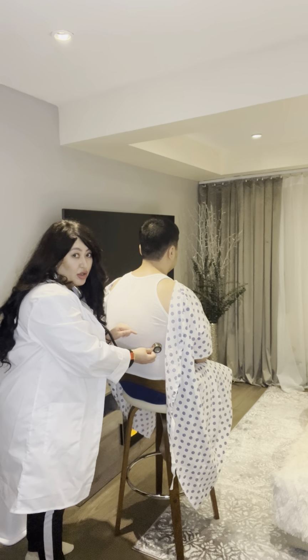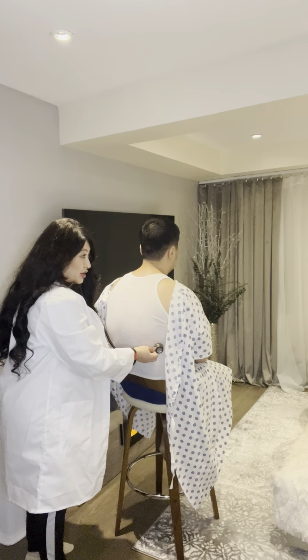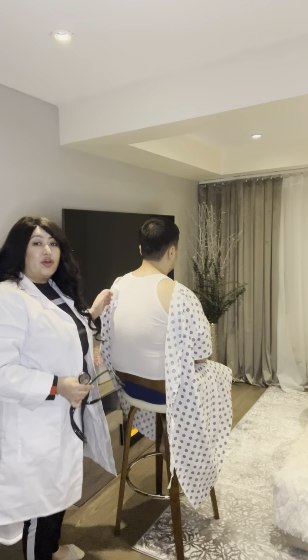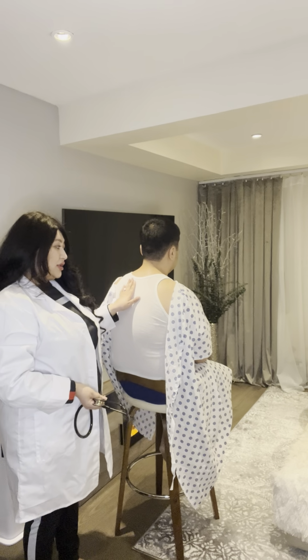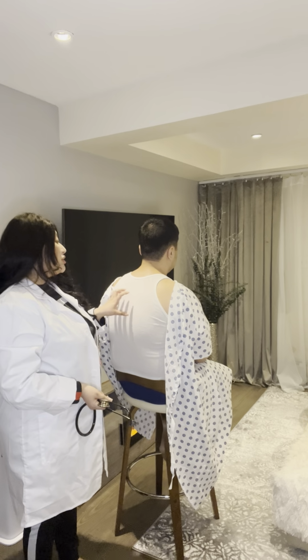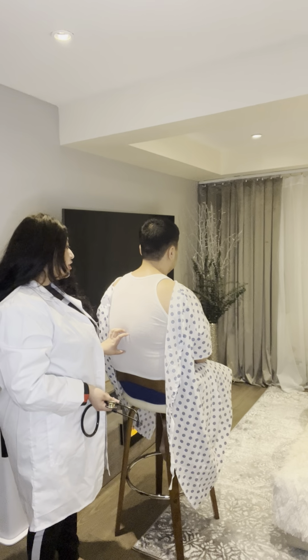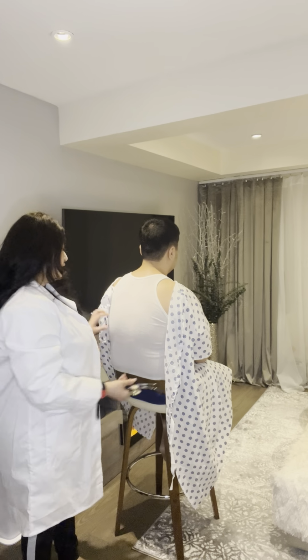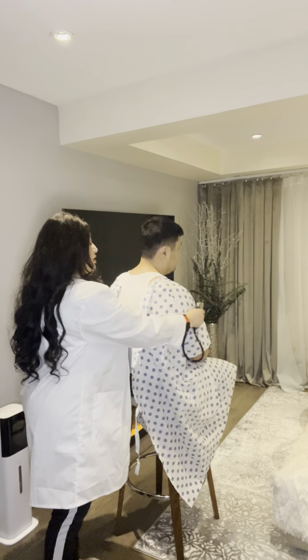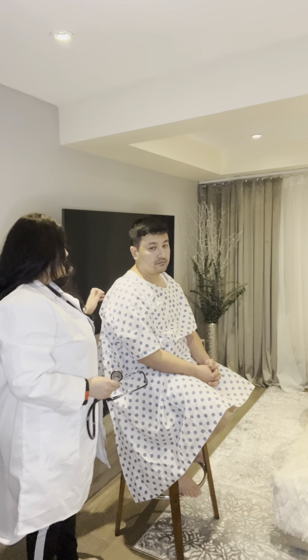And in this region on the right side, I'm hearing the right middle lobe. So I heard the bronchovesicular sounds, which are medium pitched. Then I also heard the bronchial sounds, which are loud and high pitched, and vesicular sounds, soft and low pitched. All right. And his inspirations are greater than expirations.